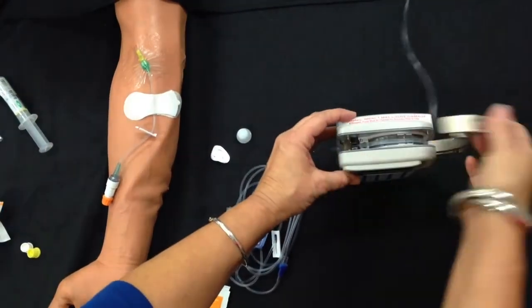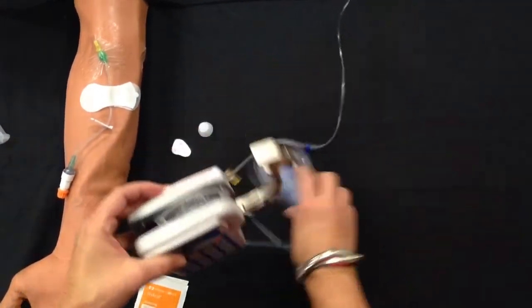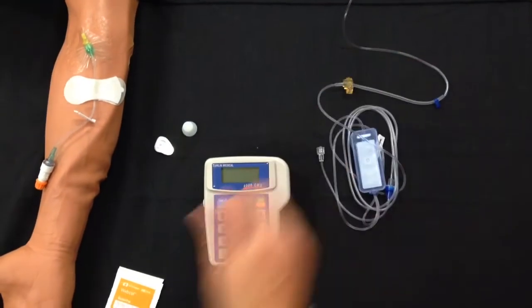Remove the tubing from the pump. Close the arm. And discard the tubing and the bag connected into the trash.